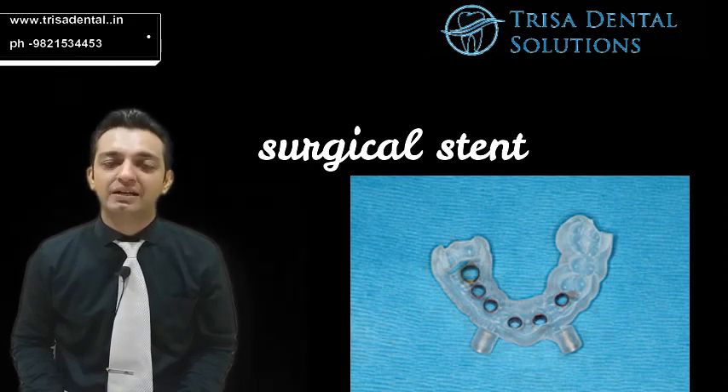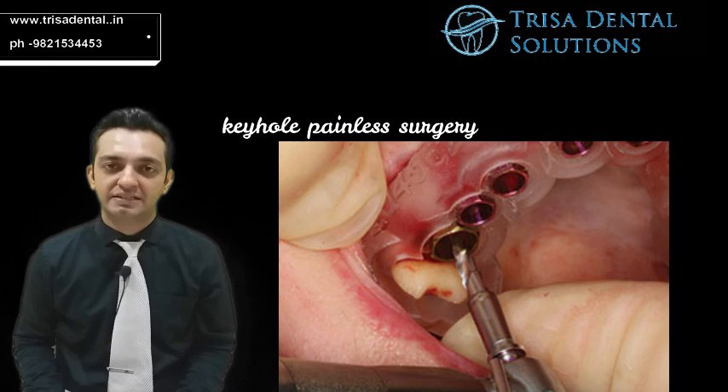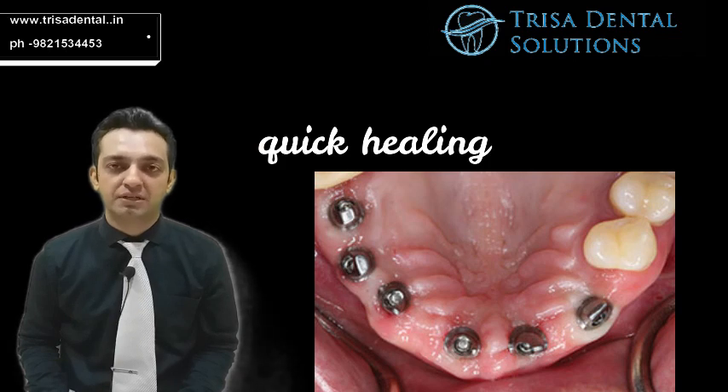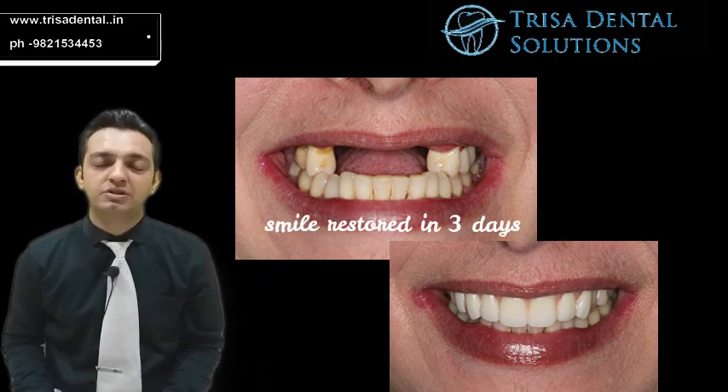This stent gives a precise direction for the dentist to drill inside your mouth without even making a cut. Yes, you heard it — absolutely there is no cut placed in your mouth, which makes it totally painless, quick and easy even for an expert surgeon. So the implant is placed in the exact position based on the 3D planning done outside the mouth. This really cuts down the operation time and helps you get the teeth faster. Thank you.